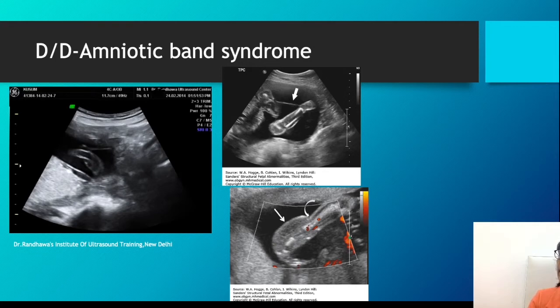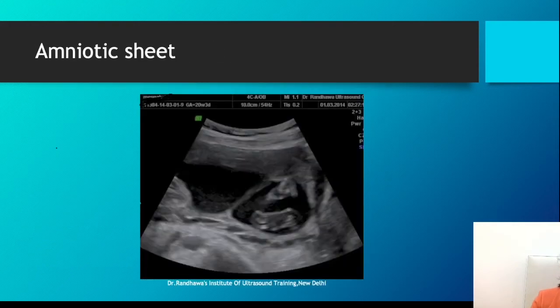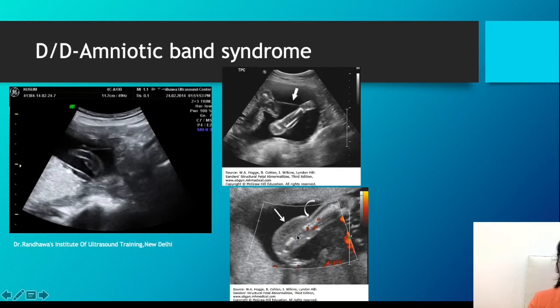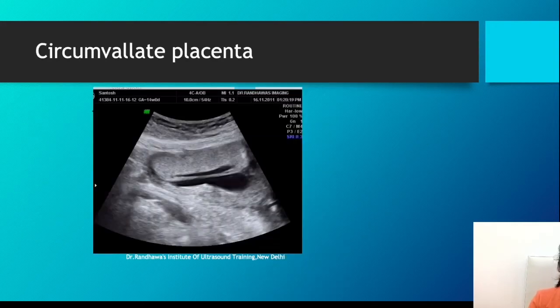How is amniotic band different from amniotic sheet? Amniotic sheet is synechia covered by membrane - it has two chorions and two amnions, making it a thicker membrane. Amniotic band is just amnion, so it is thin. The amniotic sheet will not be attached to any fetal parts and the fetus moves freely, whereas amniotic band is like a chain tied to fetal parts or cord. Because of the constriction band, part of the limb becomes edematous while the other part is normal.